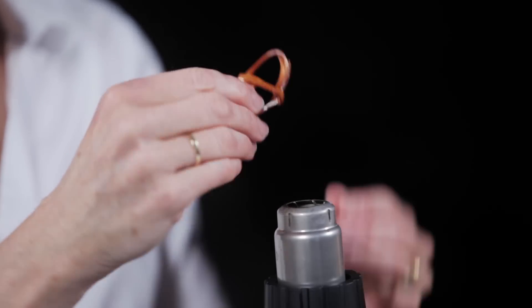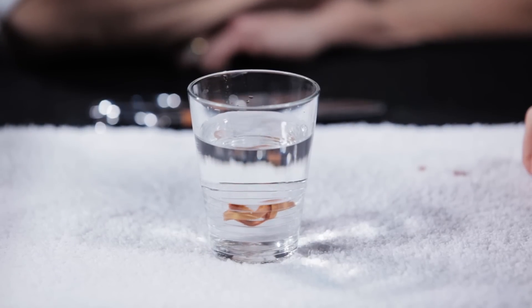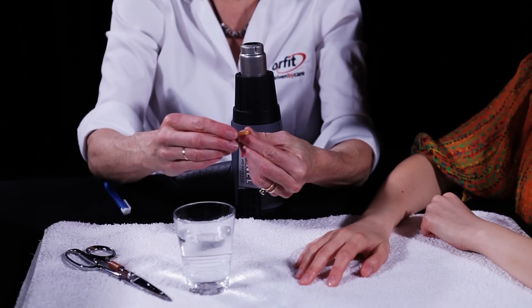Dip the entire orthosis in cool water to harden quickly and thoroughly. If placed back on the patient prior to being cooled, the thermoplastic material will stretch out and the orthosis will not be effective.